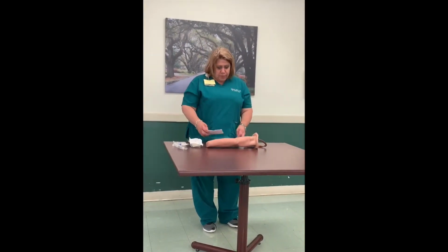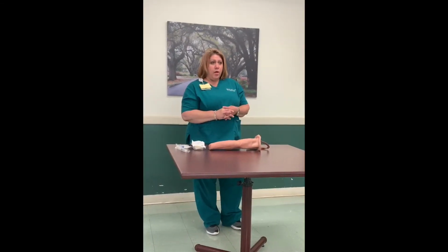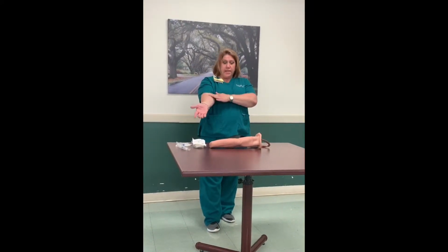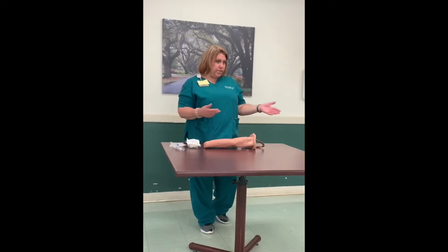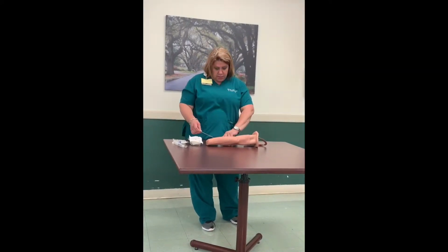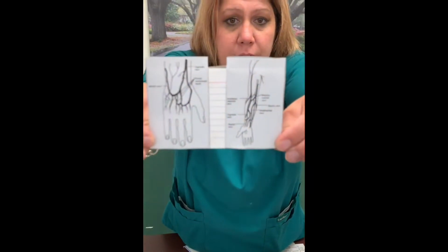So some of the things that you want to avoid with inserting a catheter: you don't want to use areas of flexion, like if you have to bend your arm, you don't want to stick it right there in the middle of the arm. You want to avoid lower extremities because those will get ripped out as you move your feet, get up and down. And any areas of skin that are already compromised, anything that's bruised, swollen, or already painful. You want to try and stick with these areas on the arm.